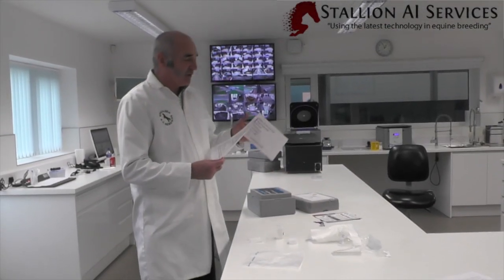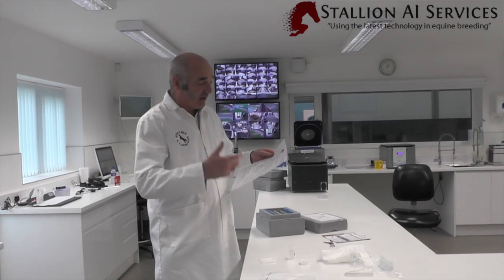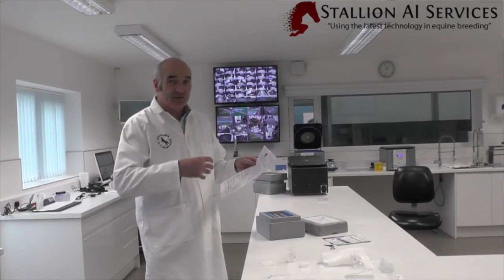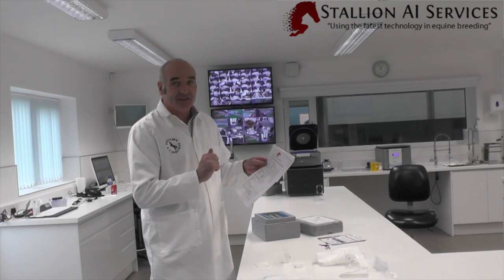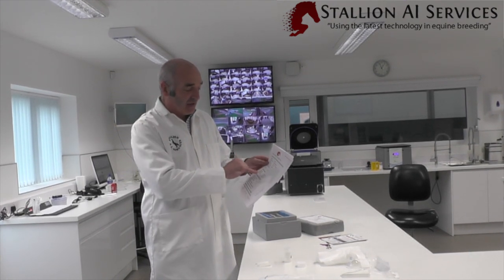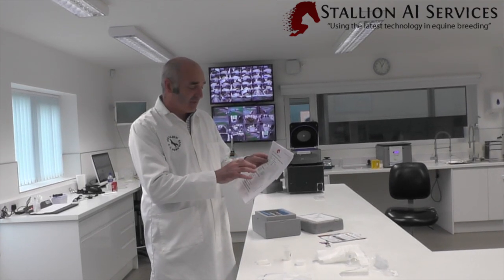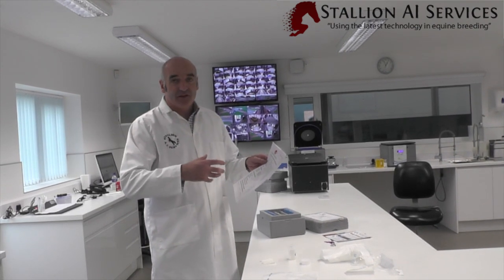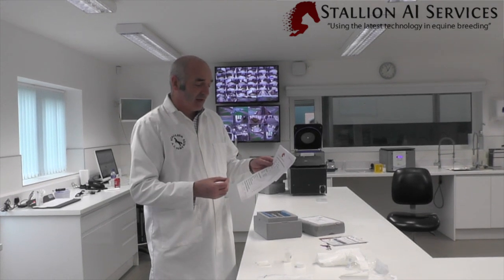It's important that we put the correct paperwork in here. When it arrives at the other end, the veterinarian needs to make sure they've got the right stallion and that it's gone to the right destination. It must have the stallion's name, the owner's name, and the health test results for the stallion confirming they're negative — so it must have EVA, EIA, and CEM results. Otherwise the veterinarian or the person AI-ing will not be able to inseminate the mare.